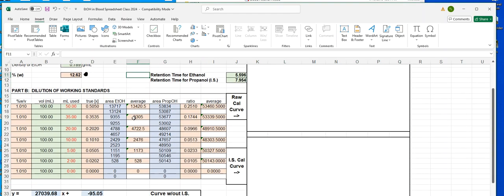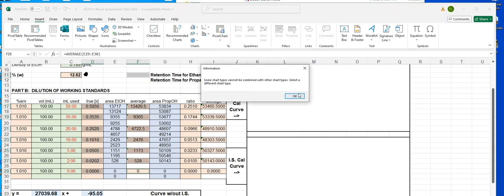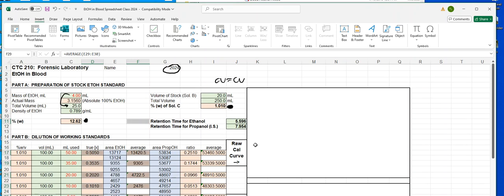Okay, well, let's just try this again. I'm going to show you a trick here. So I'm going to highlight the data just like he told me to do 5 minutes ago. And then insert, scatter, plot. Nah, sorry. Oh no, what on earth am I going to do?